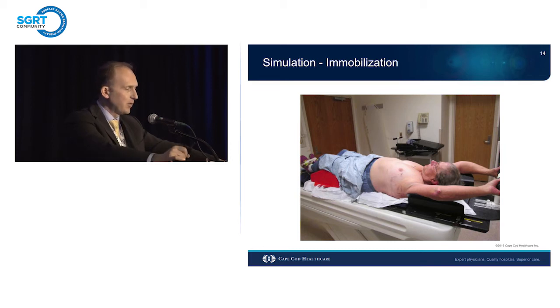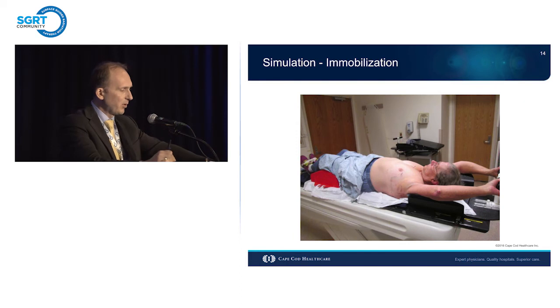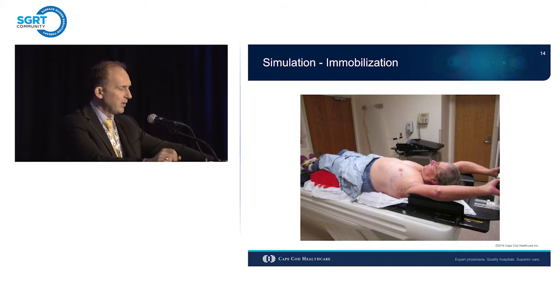One thing about going back to 4D simulations and trying to figure out if you're going to do deep inspiration breath hold or not. At some point years ago, we tried those bridges to limit the motion of the surface, right? Limit the internal motion basically by using a bridge. But that kind of defeats the purpose of acquiring sufficient data of surface motion. You're trying to perform a 4D simulation, but then you are suppressing the abdomen. There's no feedback to the cameras. You cannot put the two together, the VXP file and the image set. You just cannot process those anymore. So we really moved away from those. We're trying to do either a 4D simulation or deep inspiration breath hold, not so much compression at all.